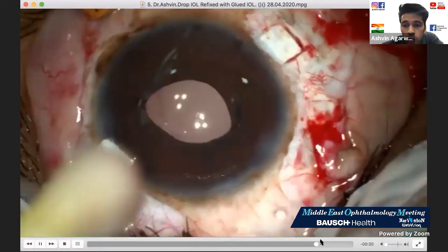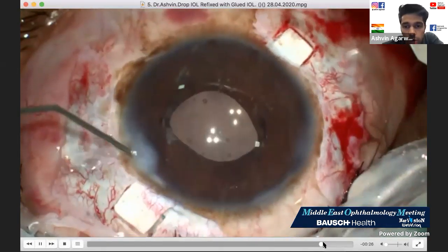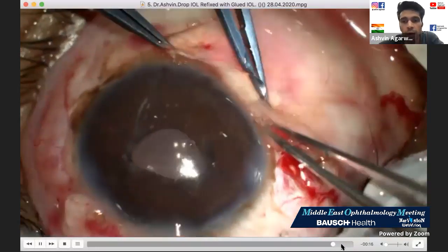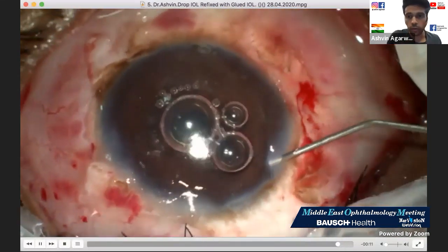I also use the suturing technique in pediatric cases, just for others' knowledge. Now next is just glue. After removing the trocars, I glue the case up. Flaps and conjunctiva are closed, and that's pretty much the end of the case in this one.